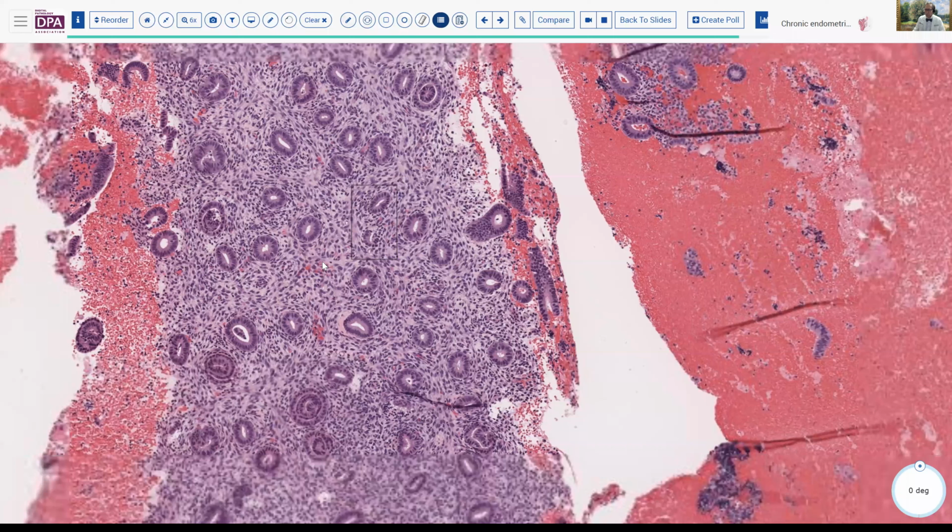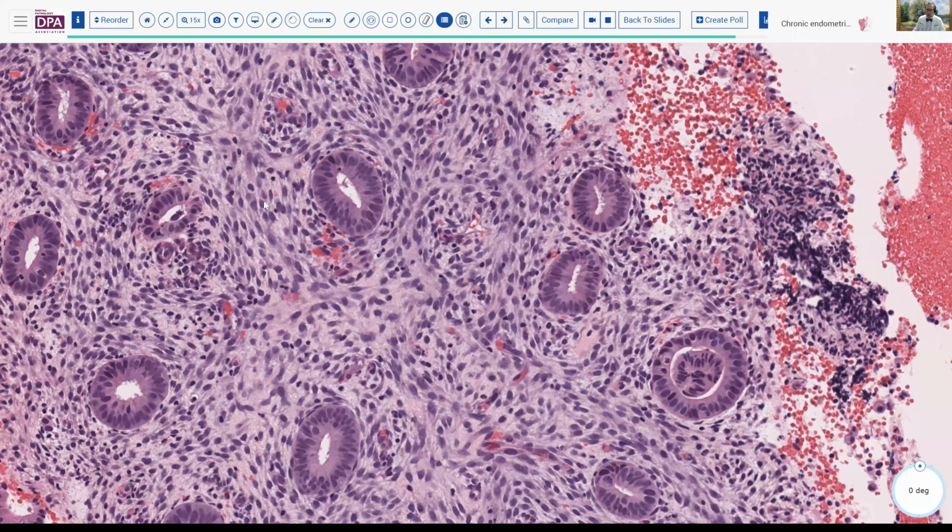So is this endometritis? Well, if I find enough of these soft features, I will then resort to doing an immunohistochemical stain to verify whether or not there are plasma cells present. And so that is what I indeed did in this case. If, on the other hand, I find plasma cells relatively easily and they seem quite classic, the immunohistochemical stain is not necessary.